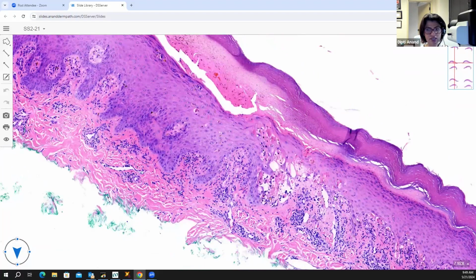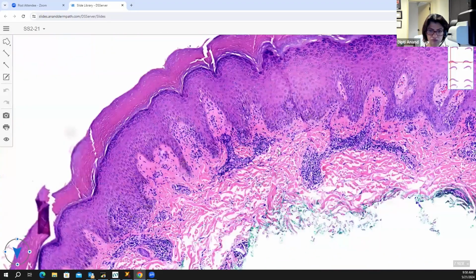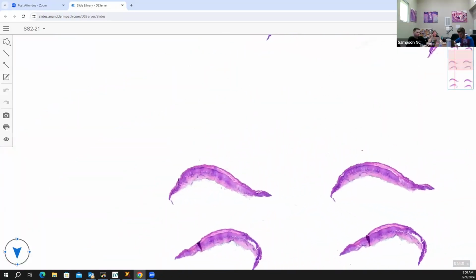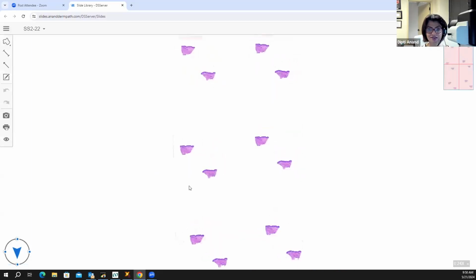And in pityriasis lichenoides, even though it's interface, the necrotics are not that prominent, unless it's a Mucha-Habermann variant where you actually get epidermal necrosis and ulceration and it's a deeper infiltrate. What is more prominent in pityriasis lichenoides is the lymphocytic exocytosis, so prominence of lymphs in the epi. Those are the differences. So this is EM. Everybody good with that? And the hand is a nice location for EM, right? Not so good for pityriasis lichenoides.